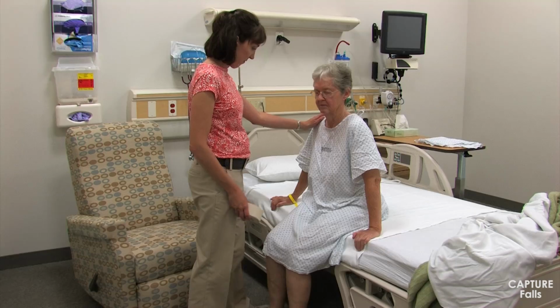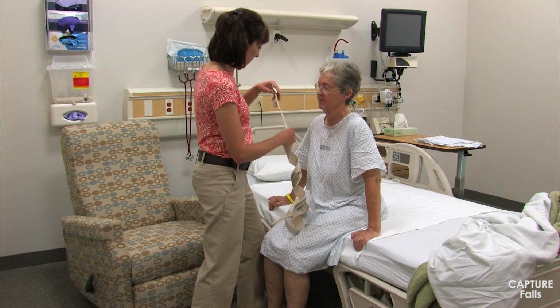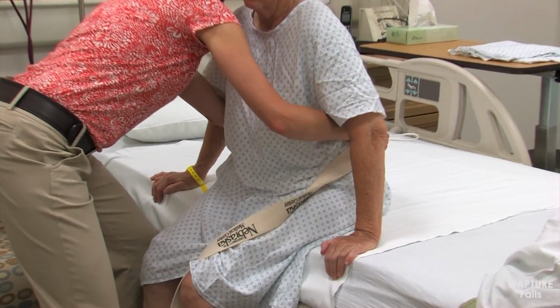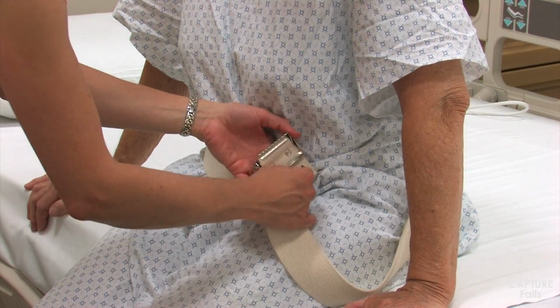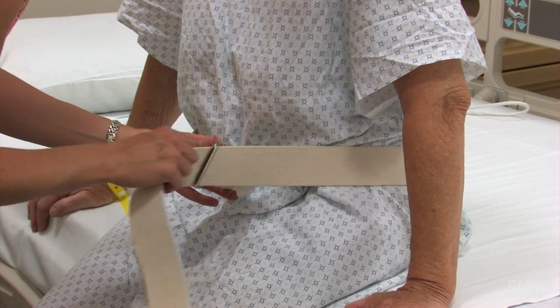One of the first things that you may want to do is explain the gait belt to the patient and why you're using it. When you apply the gait belt, it should be positioned low around the patient's waist, near her center of mass. The end of the belt goes through the buckle, through the side with the teeth first. Then, push the end of the belt through the second opening of the buckle.